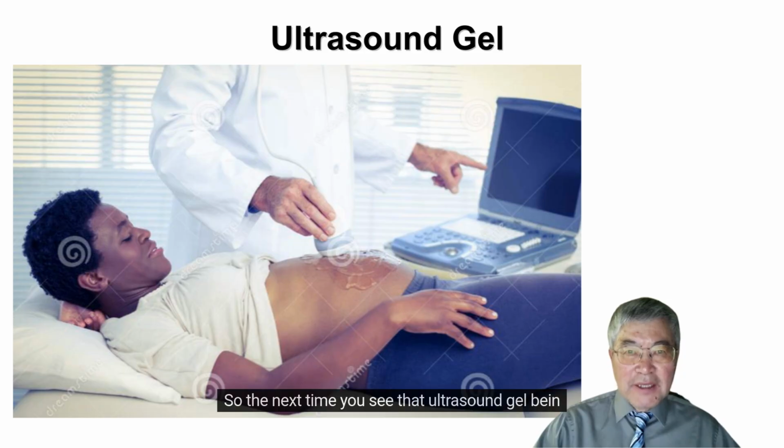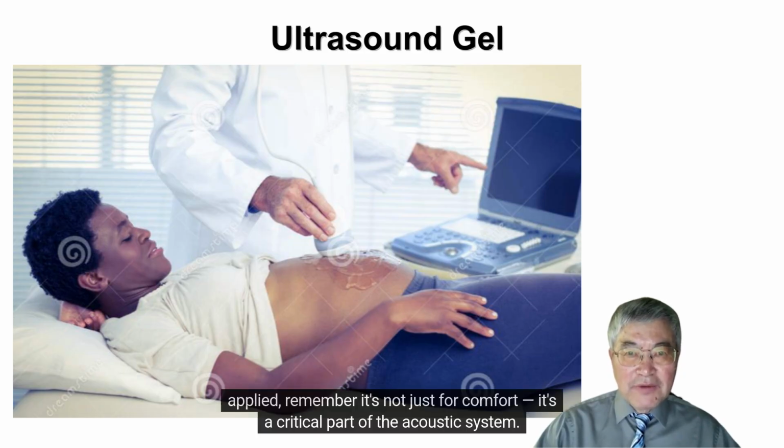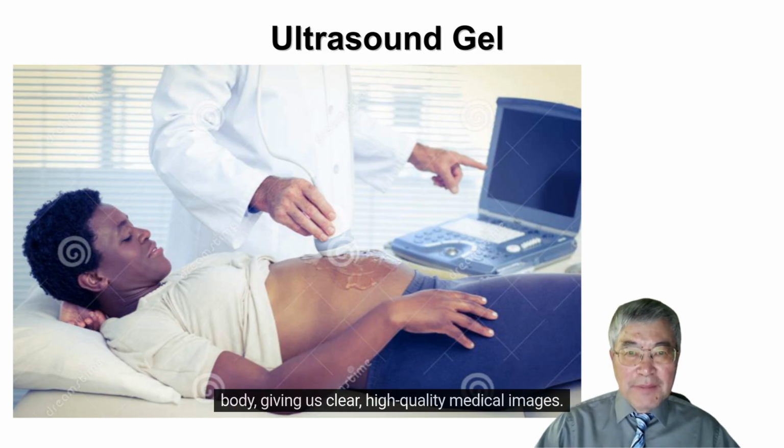So the next time you see that ultrasound gel being applied, remember it's not just for comfort, it's a critical part of the acoustic system. It's what allows the ultrasound energy to move efficiently from the transducer through the skin and into the body, giving us clear, high-quality medical images.